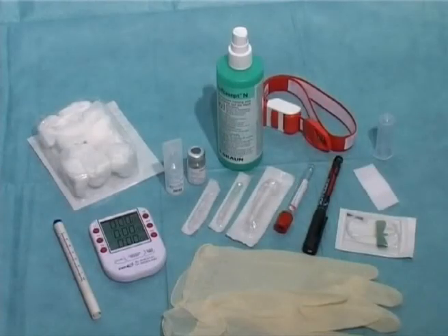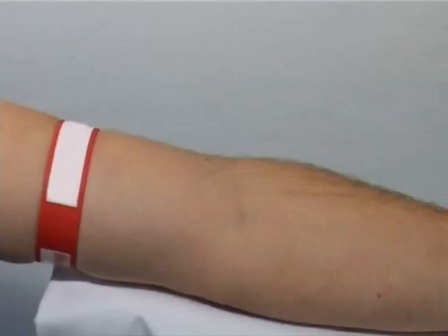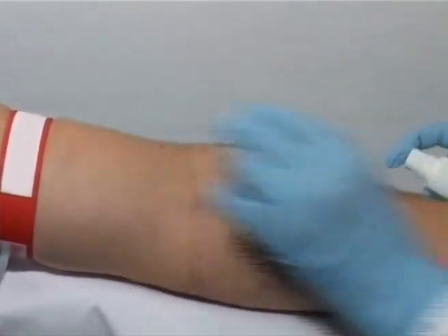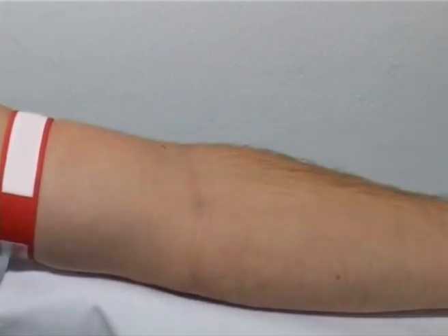ASST is a simple examination to diagnose autoreactive urticaria. The principle of the test is similar to that of an intercutaneous test, for example, for sensitization to mold or candida, only in this case it is done with the patient's own serum.